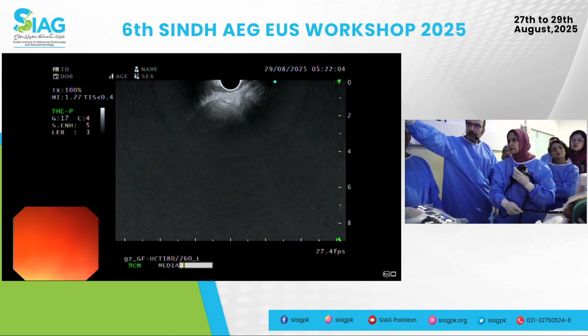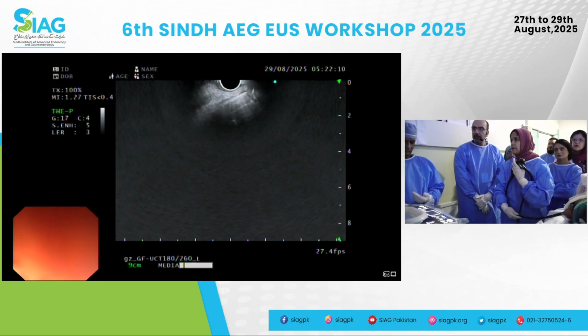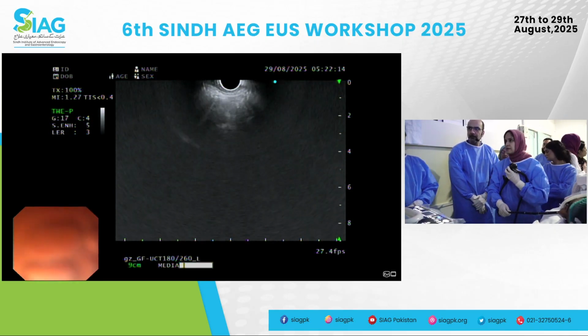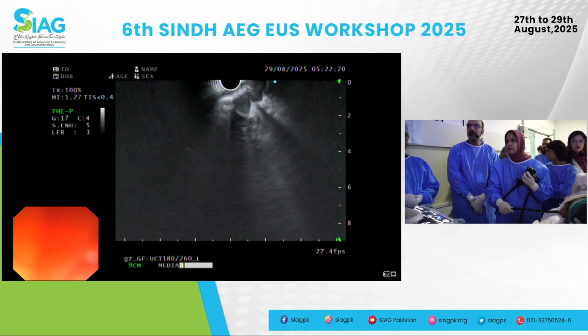There was a stricture in the pancreatic head, followed by an ERCP, which confirmed the diagnosis of pancreas divisum plus stricture. A stent was placed in June. Currently, he is here for endoscopic ultrasound evaluation of chronic pancreatitis. The stent is through the minor papilla?